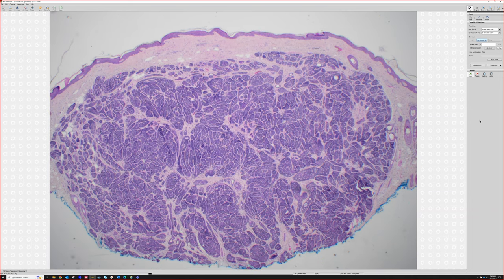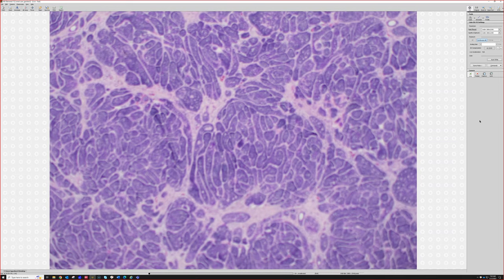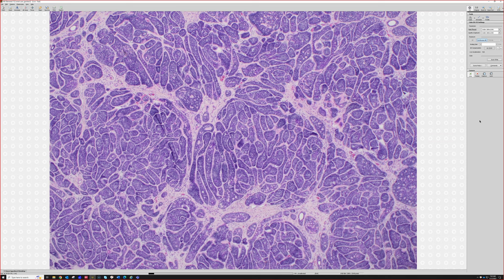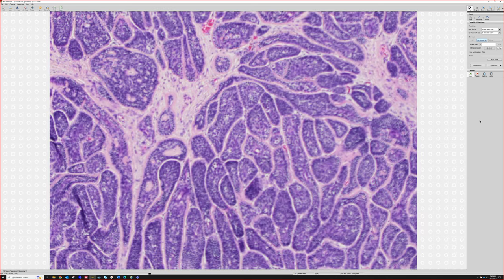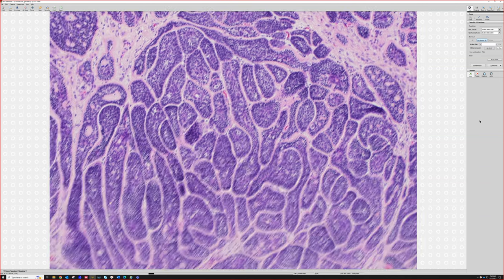Cylindroma, right? It's a blue nodule in the dermis, and there's multiple nodules. But it's similar to spiradenoma and is related to spiradenoma. They often coexist. But instead of the large blue balls or blue nodules in the dermis that you see in spiradenoma, here, your nodule is made of multiple little nests all packed together with irregular shapes, but kind of squished into each other, molded together. Some people say like puzzle pieces or spots on a giraffe, maybe if you like that, but they're all squished together.